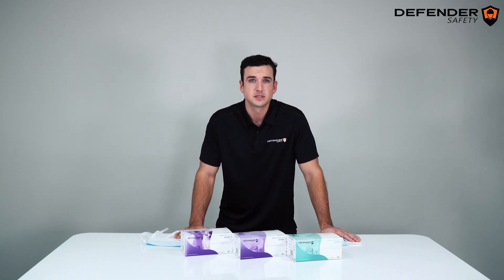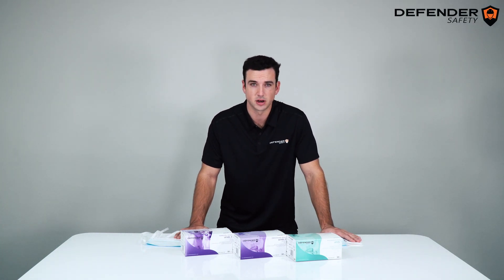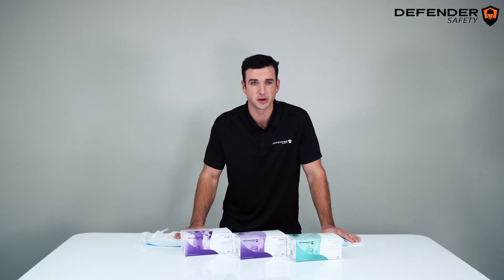When we first considered manufacturing these masks, the main objective was to engineer them with the highest regard for quality. This meant developing our own melt-blown filters and using some of the best machinery on the market.